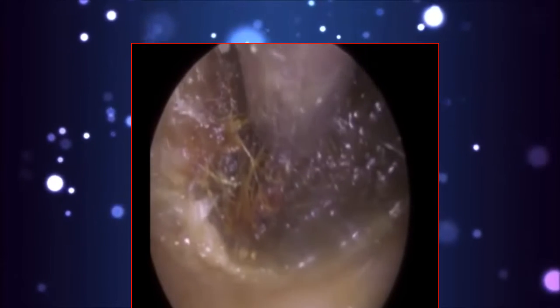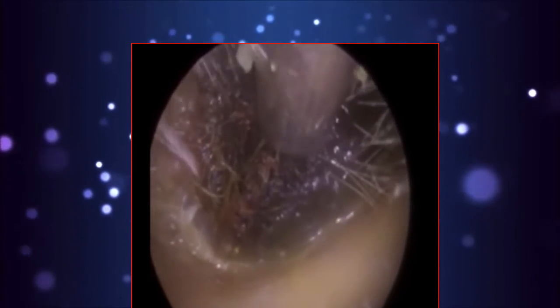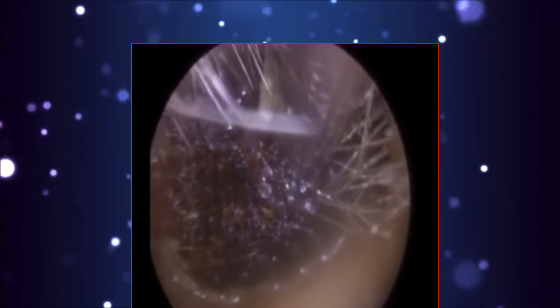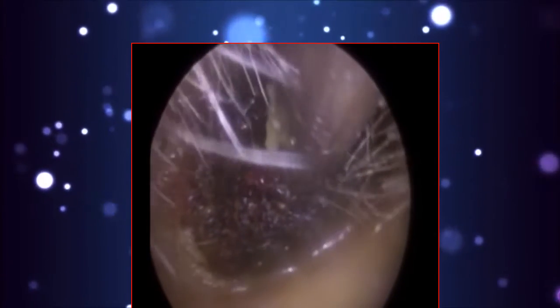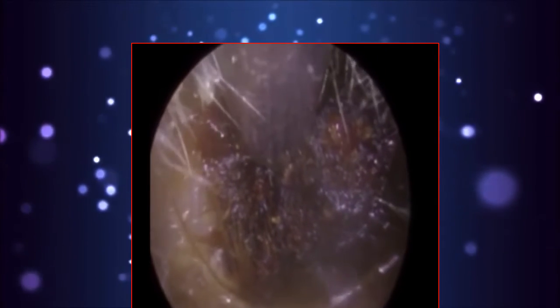So this is the patient's left ear. He had been instilling some drops, some softening agents. I think he was using olive oil, but despite that, it's a real big plug. You can see the dead keratin. If you look carefully at the ear canal, just around the perimeter where the wax is, you can see this white spongy layer. As I'm trying to remove this wax, this white layer is almost oozing out olive oil because it's been soaked quite a lot. That's dead keratin. That keratin has adhered to the wax and it's also adhered to the ear canal wall. You can compare it to double-sided sticky tape, which always makes the procedure a bit more tricky.